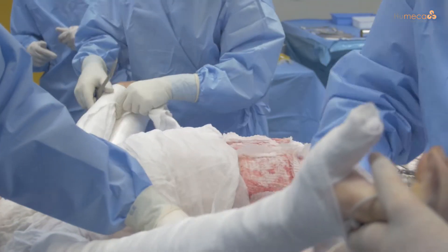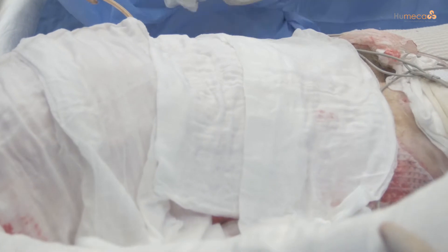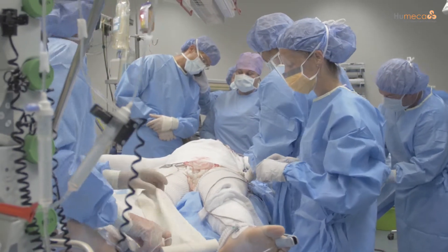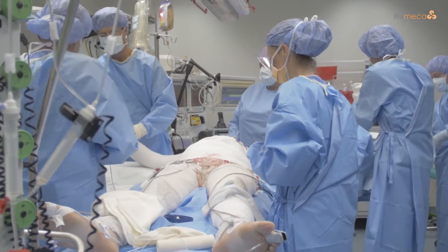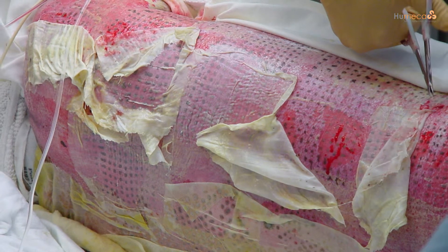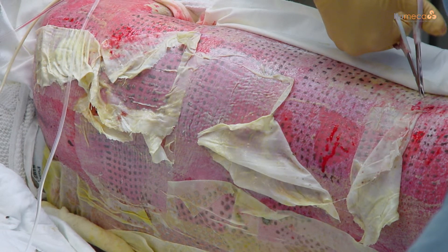These outer dressings should not be changed for the first 48 hours. After this period, the outer dressings may be changed daily, but leave the MEEK gauzes in place. The MEEK gauzes should remain in situ for 6 to 14 days. To facilitate removal, 1% Silver Sulfadiazine Cream, also known as SSD Cream, may be put on the gauzes one day prior to removal. Remove the staples and gently peel off the gauze fabric, leaving the graft islands in situ on the wound bed. It is no problem if removal is delayed after day 6, as epithelialization continues.